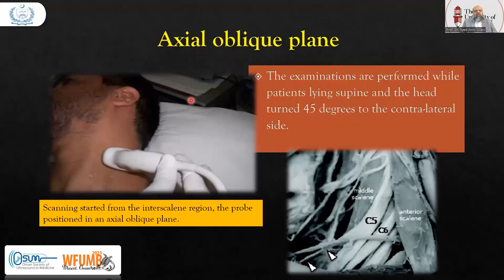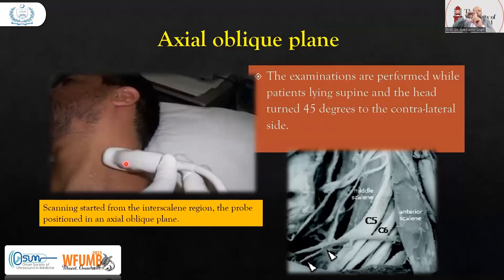This is how we start performing the scan. Here is the patient's head and neck — the head is rotated towards the right side, and we are scanning from the left. Scanning starts from the interscalene region in the scalene muscles. The probe position is in an axial oblique plane — transversely placed but slightly oblique. The examinations are performed with the patient lying supine, with the head turned 45 degrees to the contralateral side.